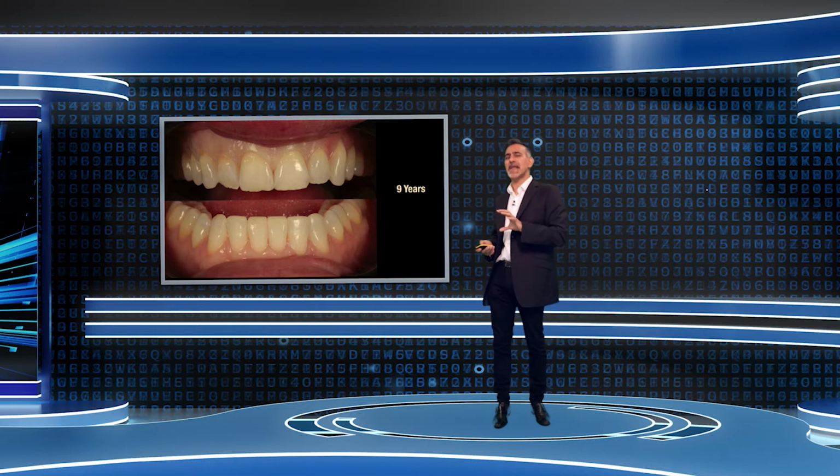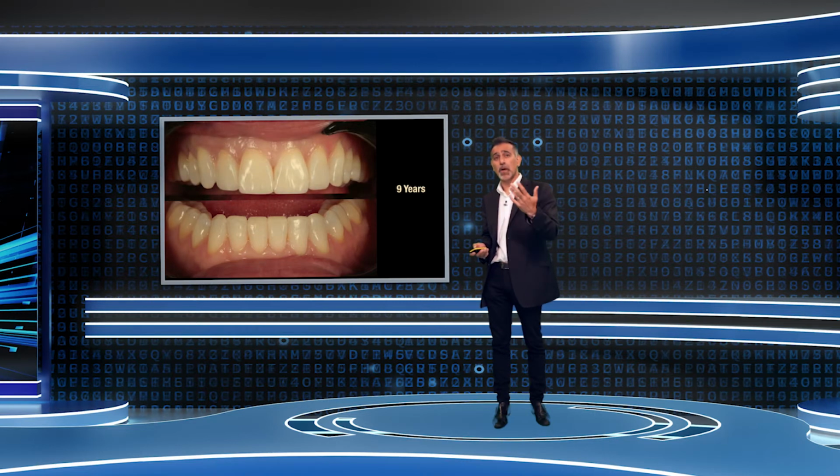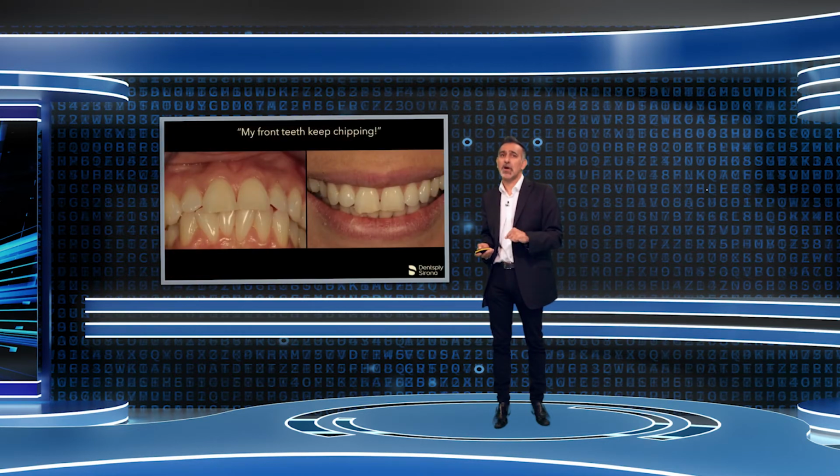So here we are 9 years later, no veneers needed, no veneers ever placed, and we've removed the old material, and now we've gone back to square one and just placed new material on the teeth. And considering the average veneer or crown, I think it's 9 or 10 years, this is a great alternative to that more traditional style of treatment.